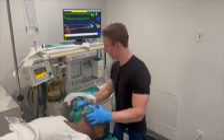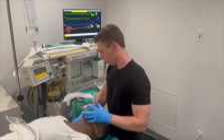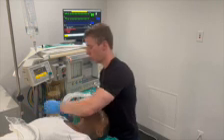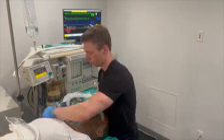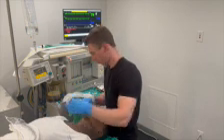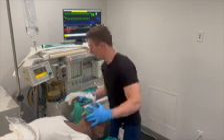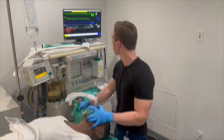Once the ability to ventilate is established, it is time to paralyze the patient. Administer rocuronium 0.6 milligrams per kilogram and then resume ventilation. Many anesthesia machines have a timer button on the screen that you can press after rocuronium has been given. Continue to ventilate the patient with the anesthetic gas while waiting for the 90 seconds it takes for the rocuronium to take effect.